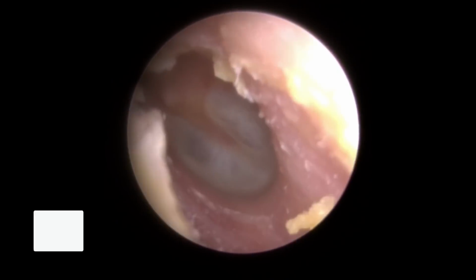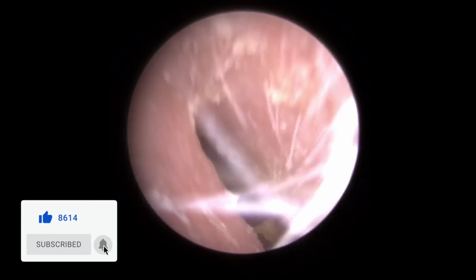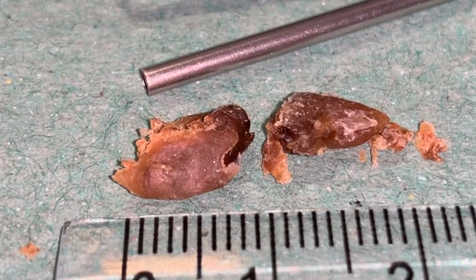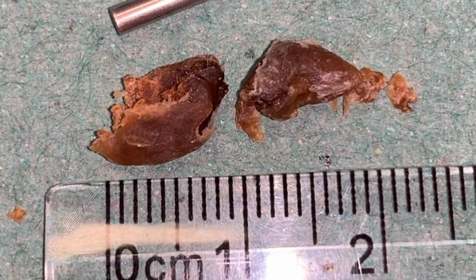And if we take a look behind that, we can see a little bit of dry skin. That was scraped away now with the Jobson horn, just so we can get a good look at the eardrum. We take a look at the drum, we can see a little bit of calcification to the skin, really, so a little bit of misting to the skin. These are the pieces we removed, so you can see they're quite hard, brittle little pieces.